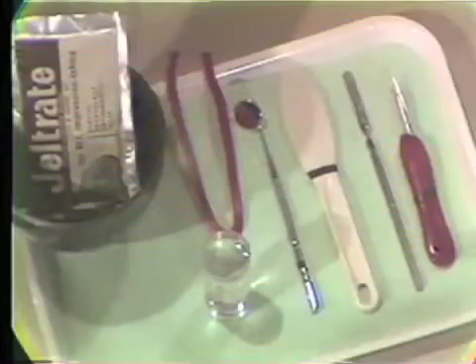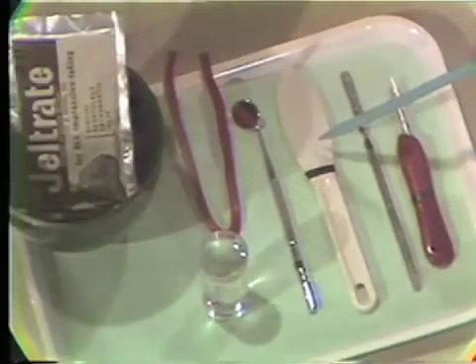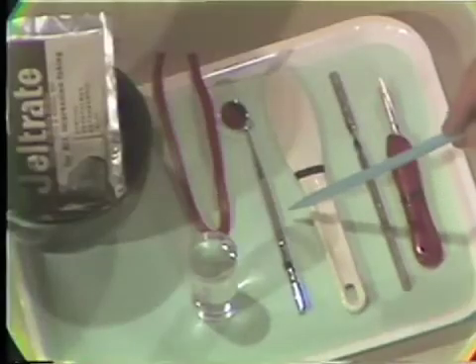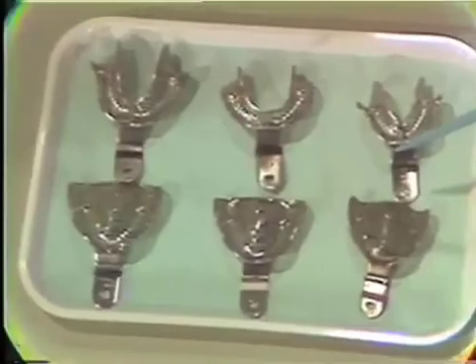A well-made preliminary impression and subsequent preliminary cast are necessary in order to construct an accurate final impression tray. The materials necessary to secure preliminary impressions for the edentulous patient are alginate and rubber bowl, an alginate spatula, a cement spatula, a red-handled knife, a mouth mirror, soft red wax rope, a water measure, and a selection of Winkler-McGowan edentulous alginate trays.